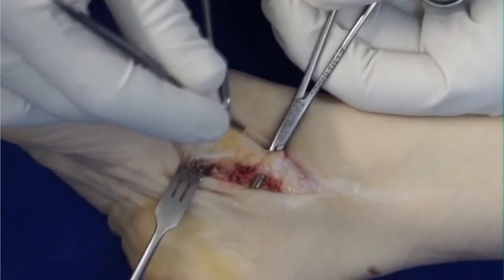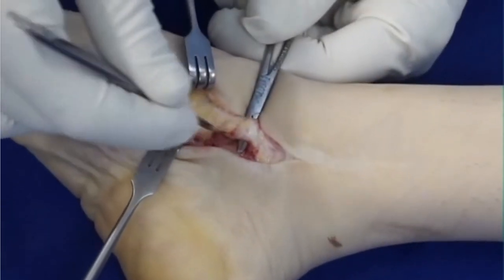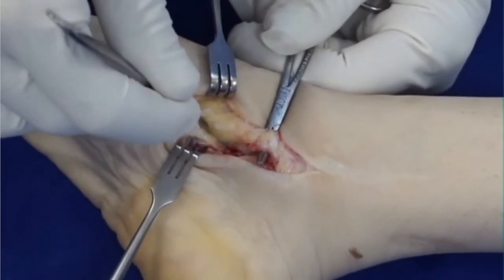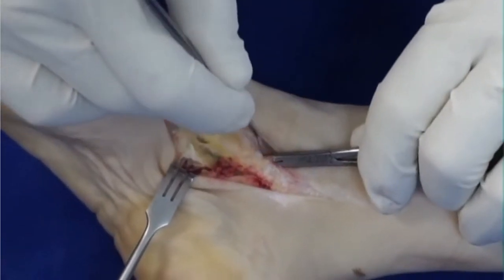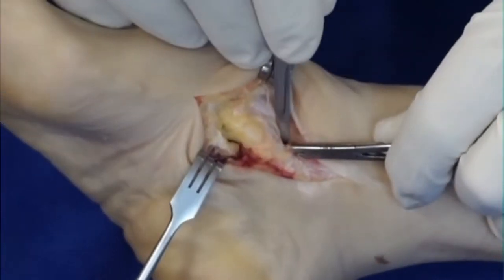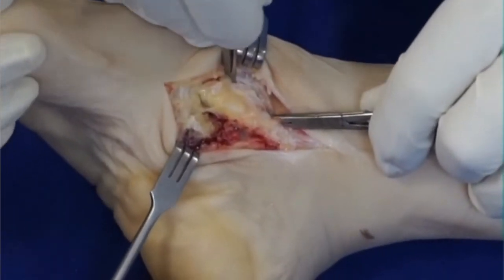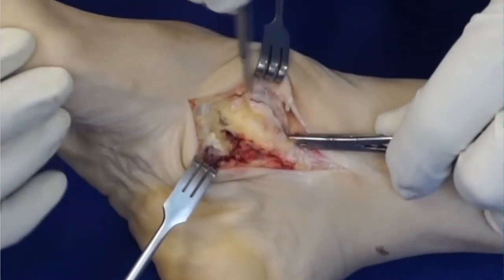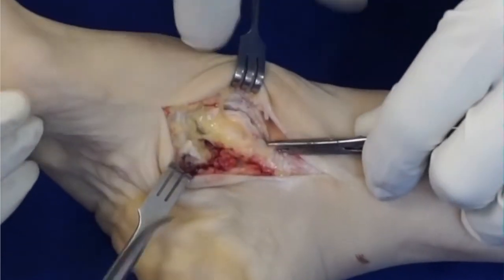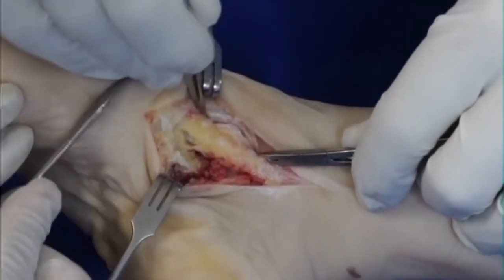I begin with the posterior tibial tendon transfer. This is done by extending the incision not to the navicular, but all the way out to the cuneiform. You want as long a piece of tendon as is possible, because if you cut it at the level of the navicular, your tendon length will often not be long enough. So I'm going to go subperiosteally all the way over the cuneiform and take off a longer piece or strip of fascia, periosteum, and tendon.